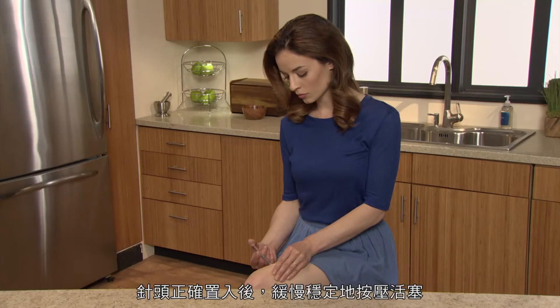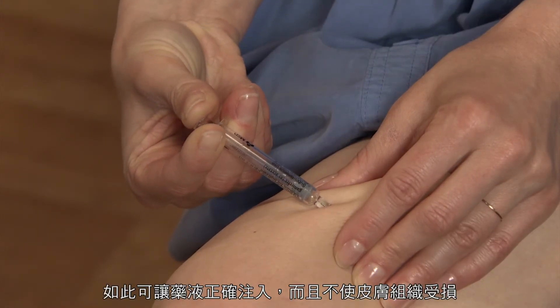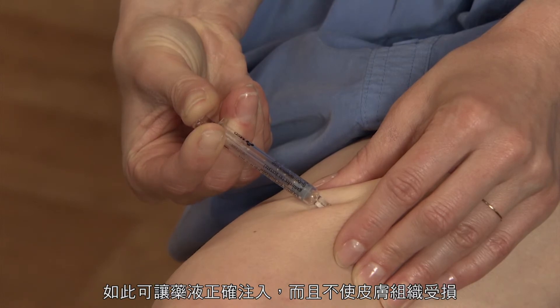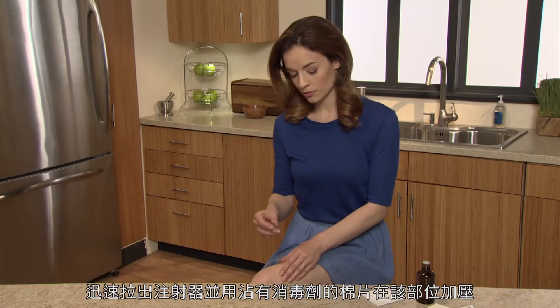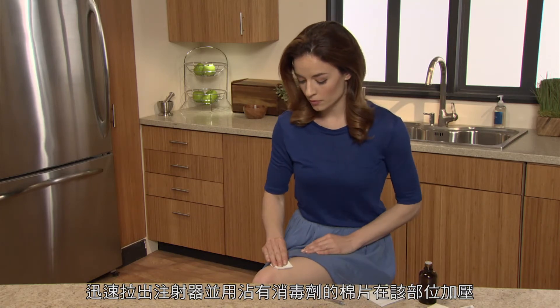Once the needle has been correctly placed, depress the plunger slowly and steadily so the solution is correctly injected and the skin tissues are not damaged. Pull the syringe out quickly and apply pressure to the site with a swab containing disinfectant.